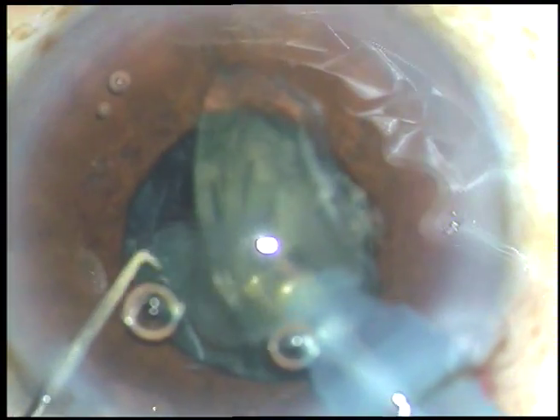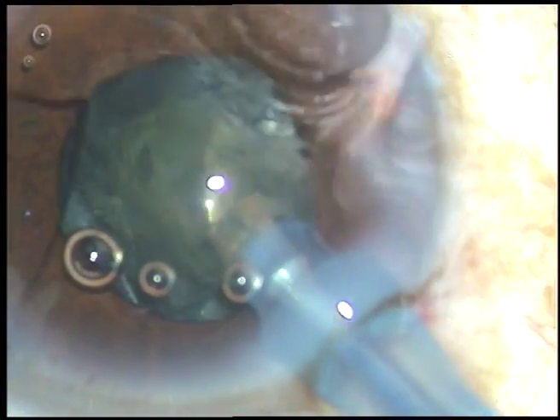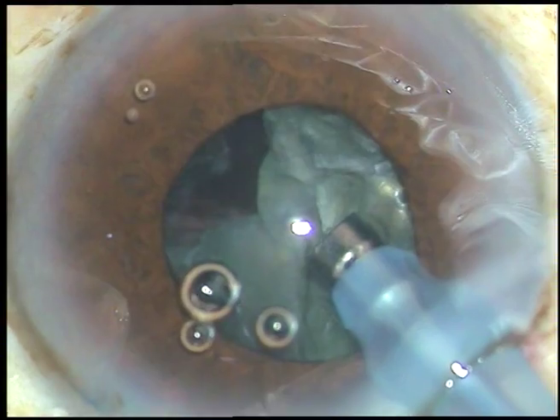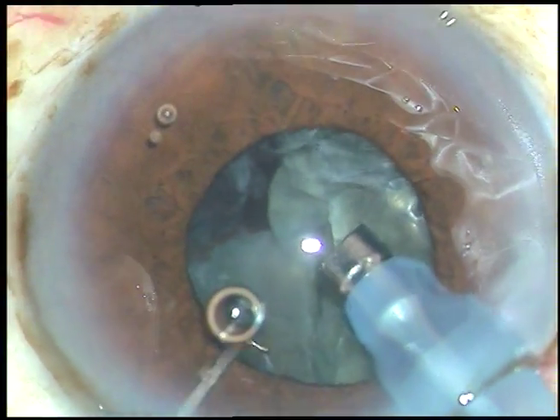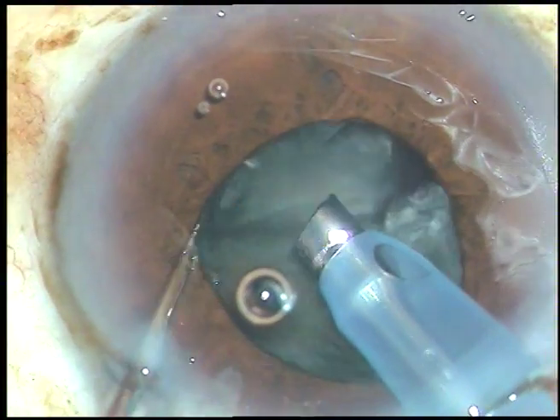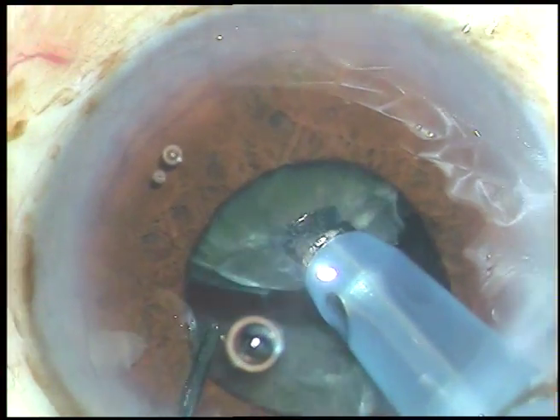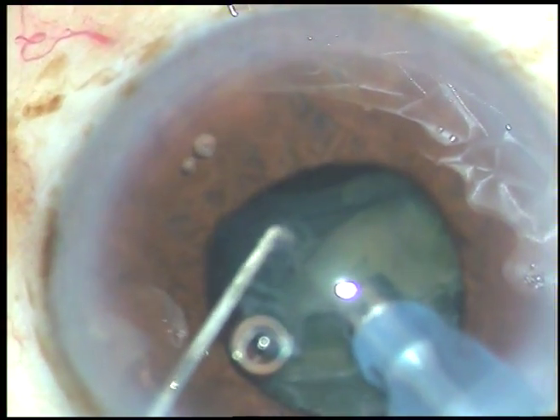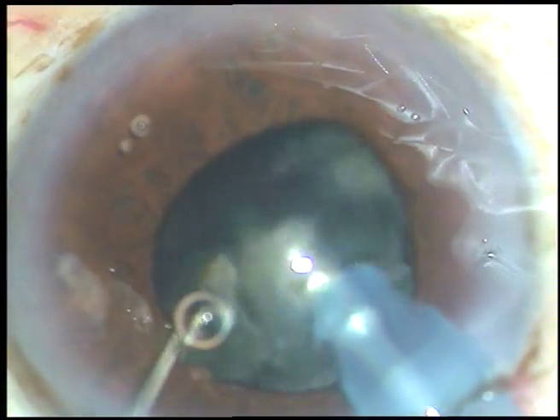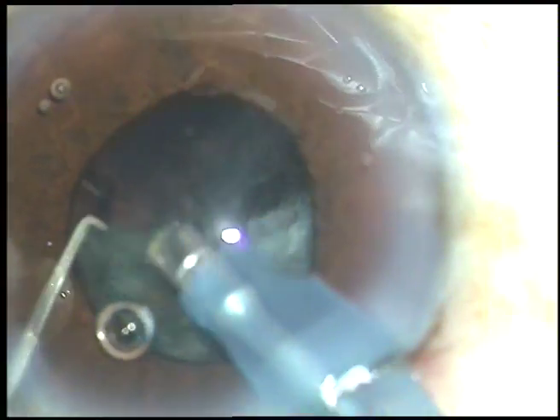This nuclear fragment is being emulsified. Since the cataract is soft, I am sure I will be able to manage this case with this pupil size. But if the cataract is very hard, I don't take chances — I don't take the risk of doing very hard cataracts when the pupil is small. I use hooks or some kind of pupil expansion device.